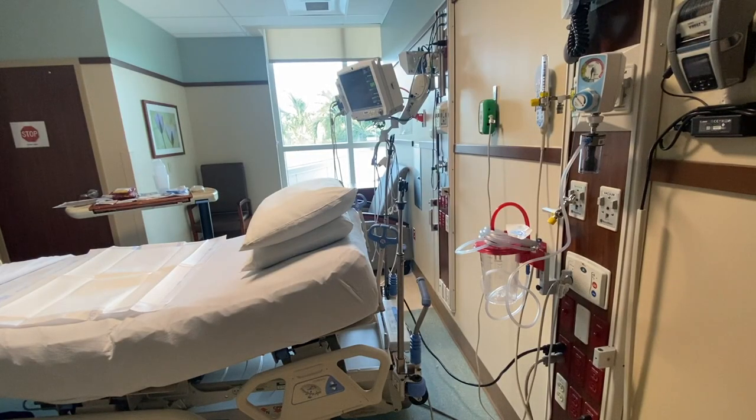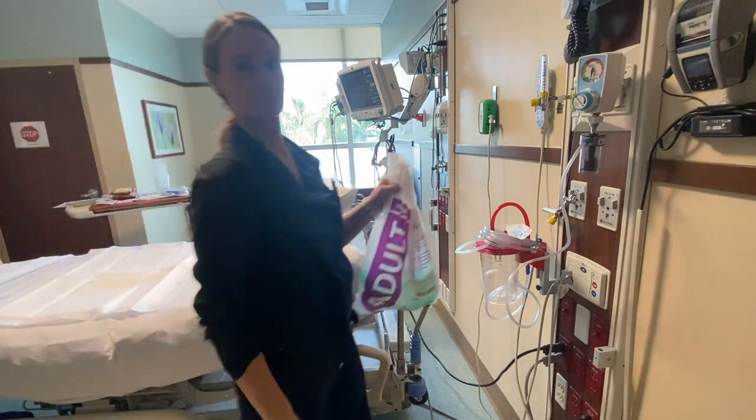The most important item in an ICU room is the ambu bag. So I'm going to put the ambu bag in the room.